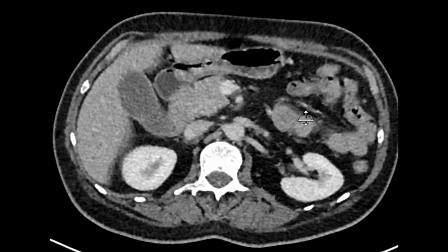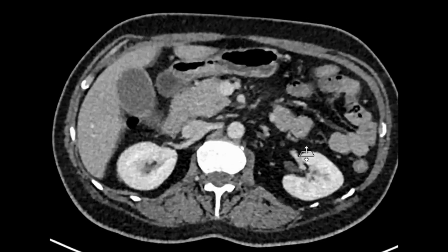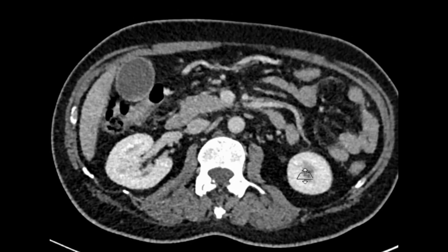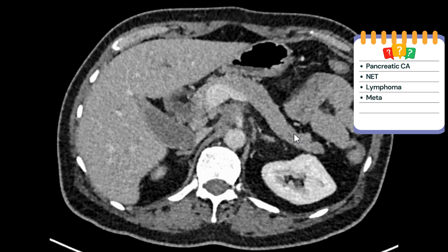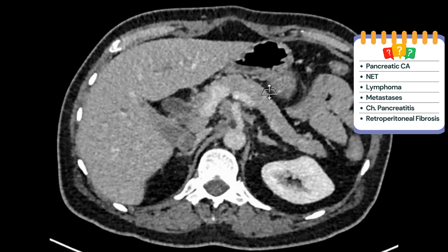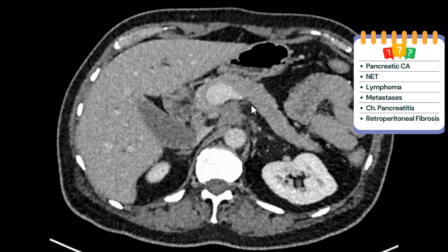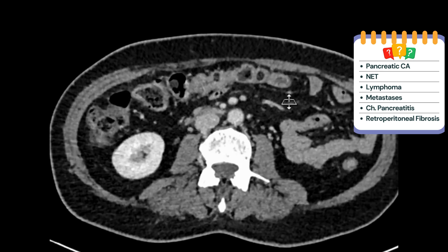One possibility coming to mind is a pancreatic tumor not clearly seen on CT — this can happen, as this is not a pancreatic protocol study and we did not image in triple phase. Pancreatic tumors can be very subtle. Having no pancreatic ductal dilatation is a bit unusual, however. This cuff of soft tissue thickening around the celiac axis and SMA is an indirect sign of pancreatic malignancy, though not specific — it can also be seen with neuroendocrine tumors, metastatic lymph nodes, lymphoma, chronic pancreatitis, or retroperitoneal fibrosis. I would exclude pancreatitis and retroperitoneal fibrosis here, as there are no calcifications, ductal dilatation, parenchymal distortion, or urinary obstruction.